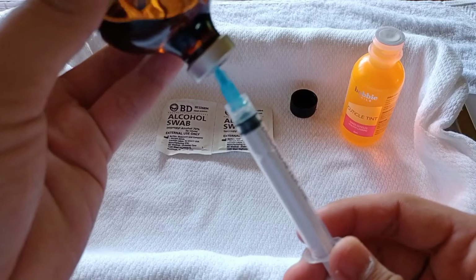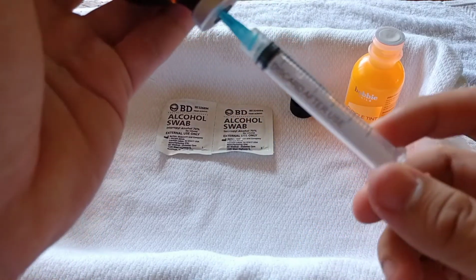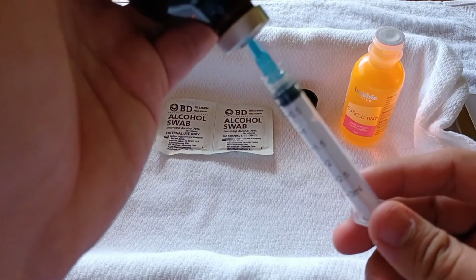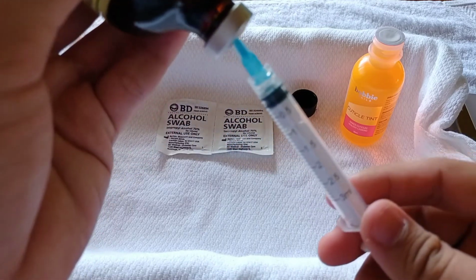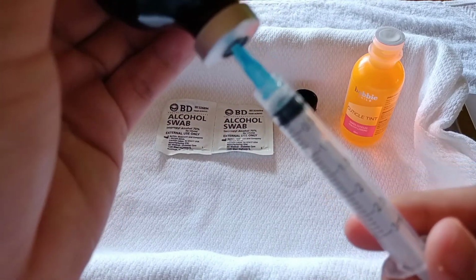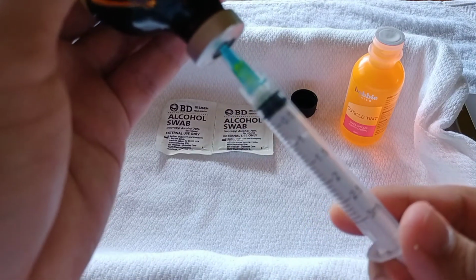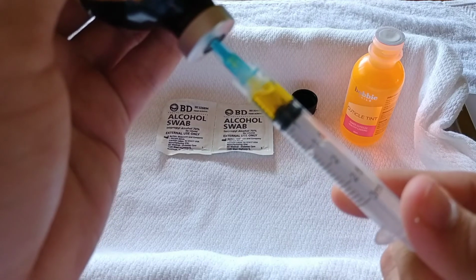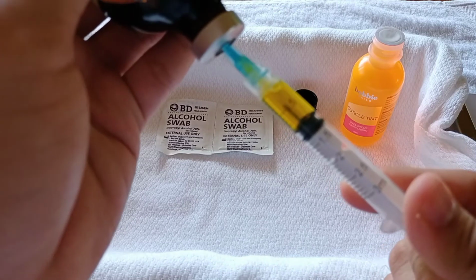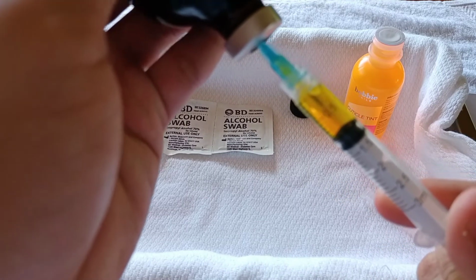Keeping the needle inserted, control the syringe with the dominant hand and keep the plunger down with the thumb. Pull the needle back to a point where the needle is beneath the fluid level. Keep the needle there as long as the fluid is withdrawn. Slowly pull the end of the plunger back until the appropriate amount of solution is aspirated into the syringe.